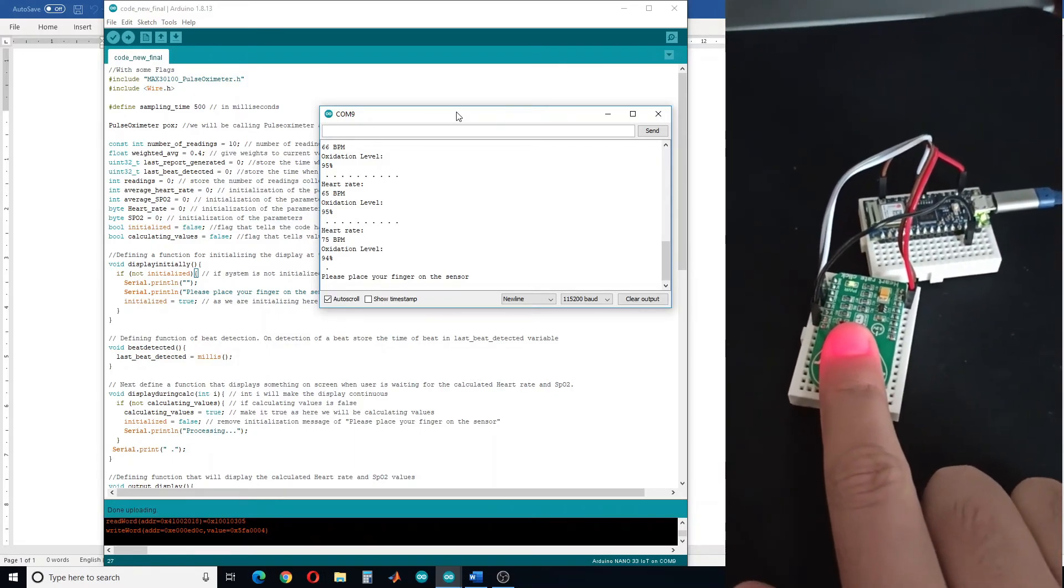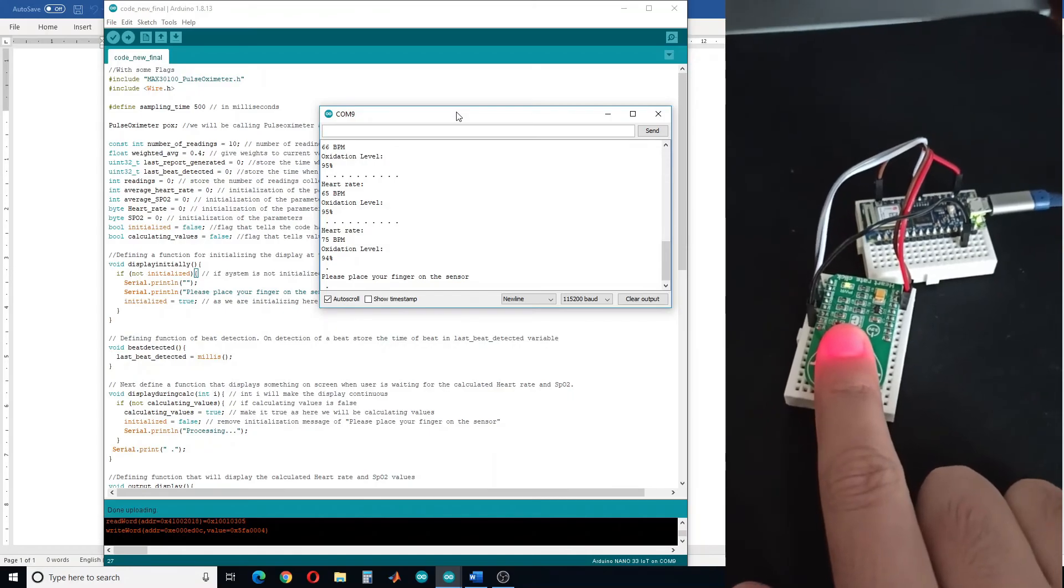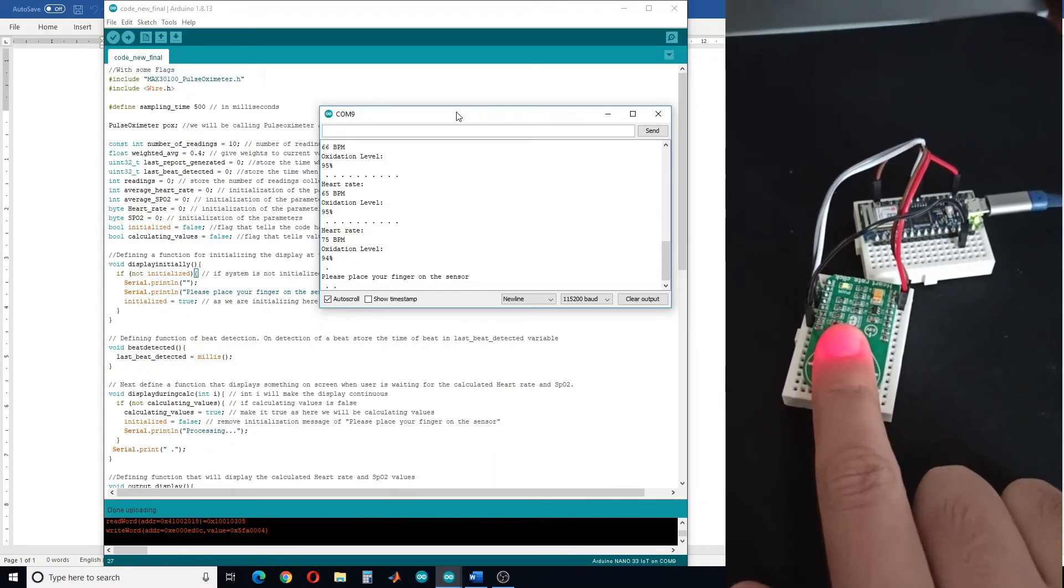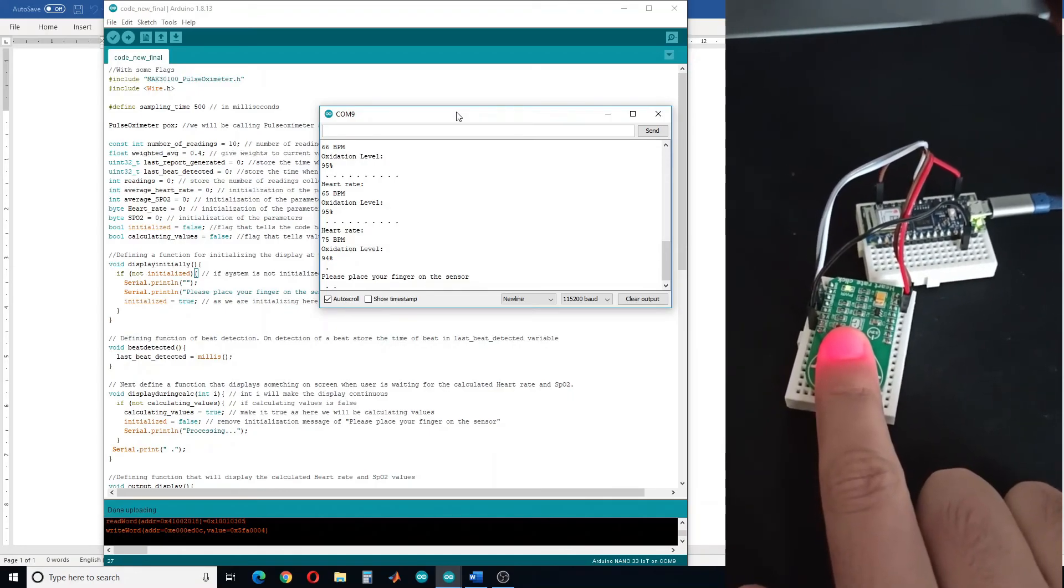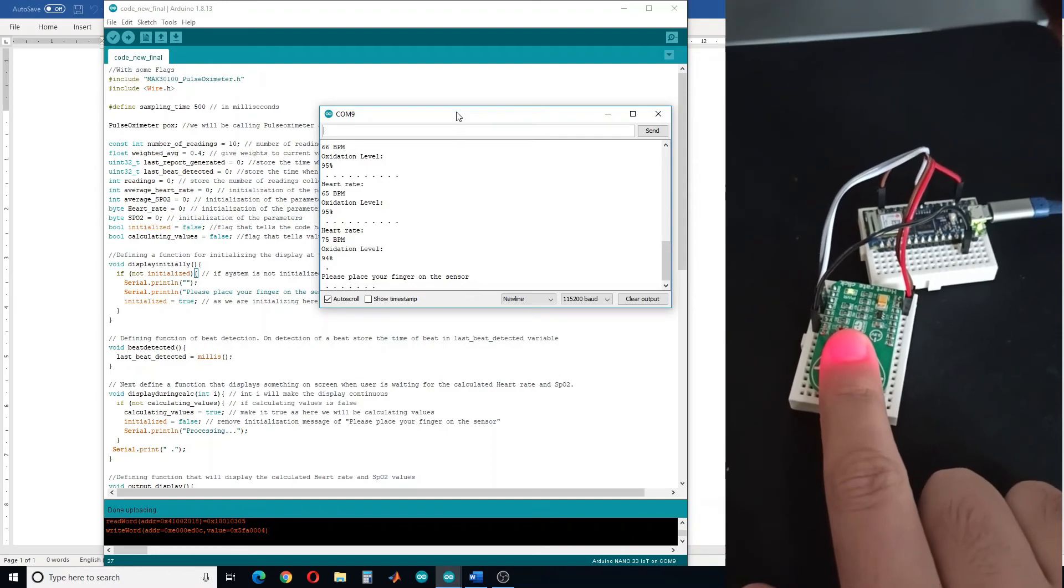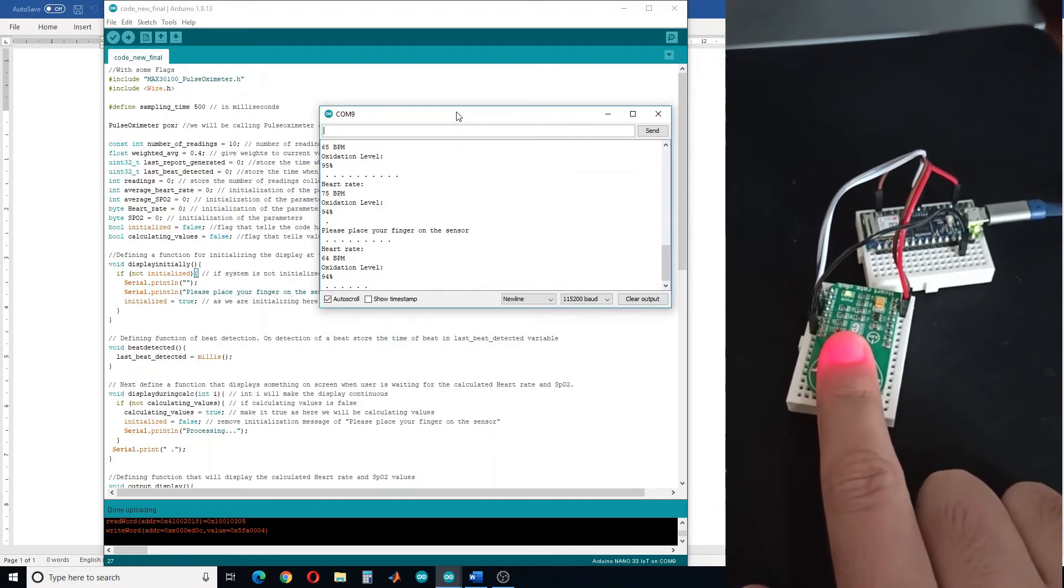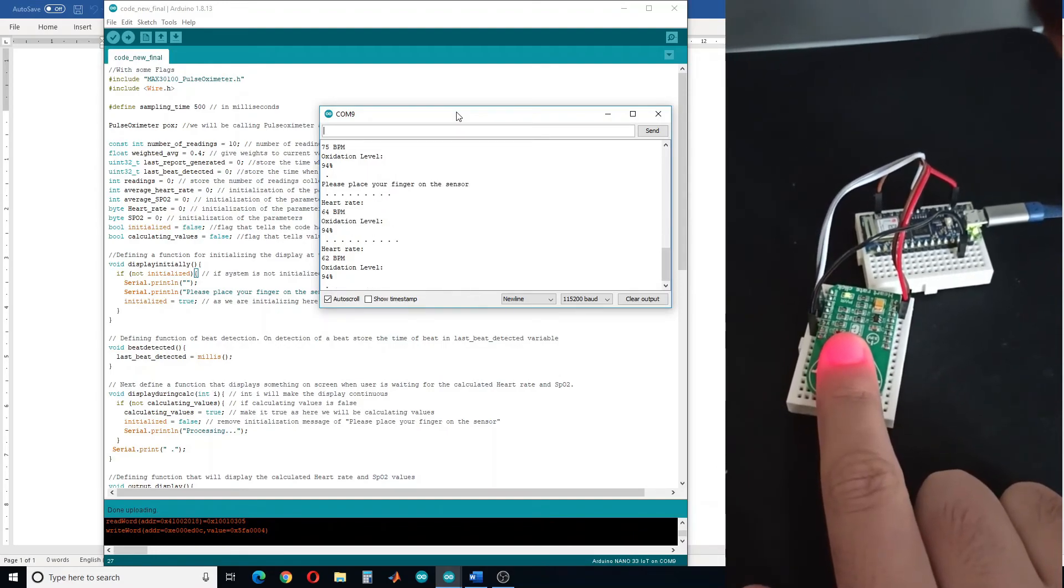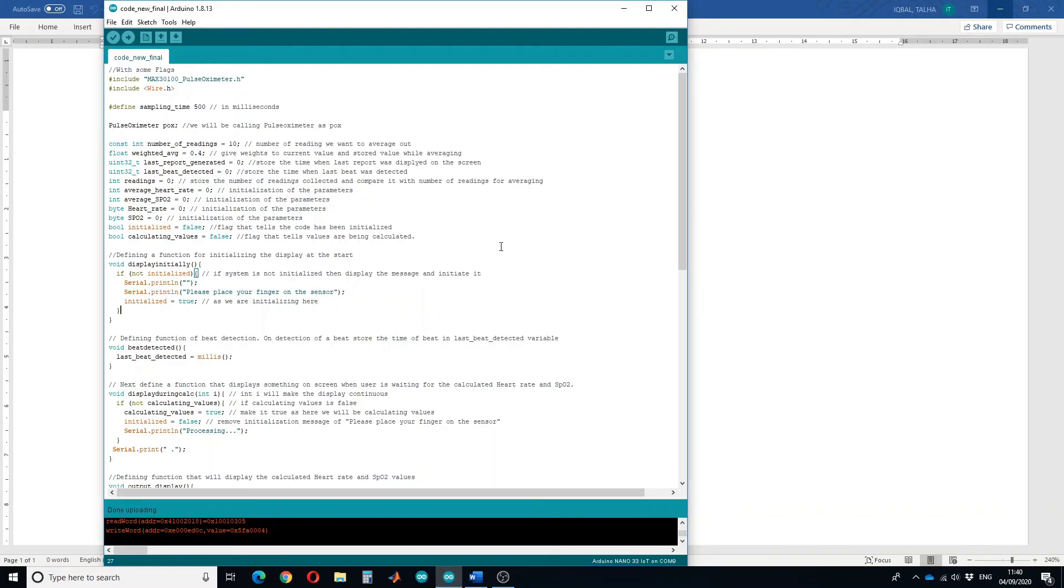Then when I place my finger on the sensor, after a few seconds it will start reading. In this way you can design a heart rate monitor that provides stable reading at the output.